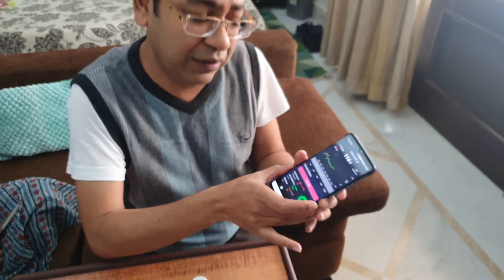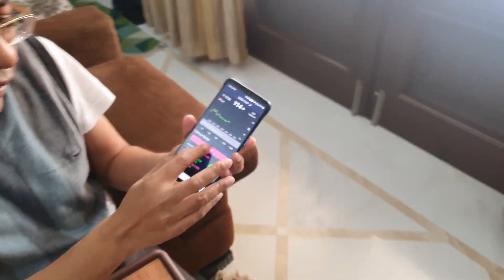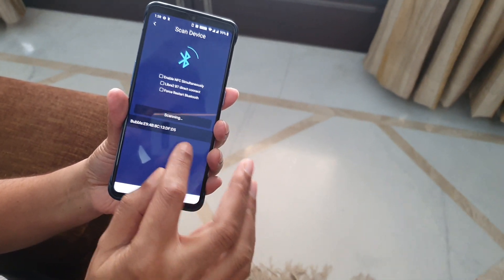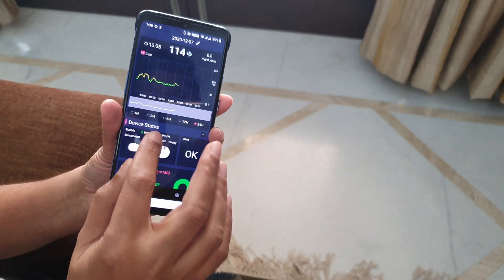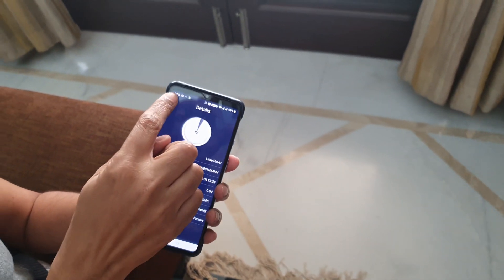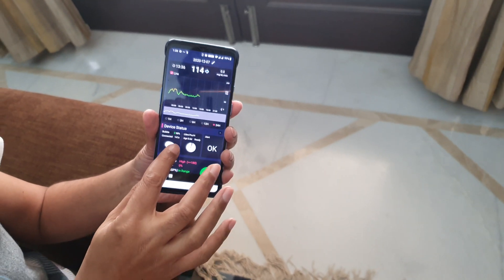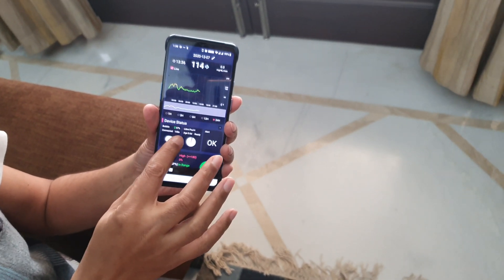After it is reset, it is very simple — click Add CGM, select Abbott, scan, select Bubble, and you will see it is connected again. It will take a reading within about 140 seconds.